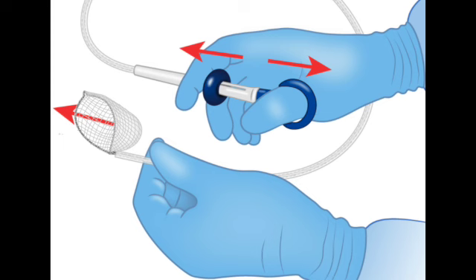Okay, so how do you maintain that orientation? This is another one of those clever, practical solutions. You take the large polyp, lay it out carefully, maybe spread it a bit flat, and then you pin it to a small piece of cardboard. Pin it, like with actual pins. Usually, yes, small pins, carefully placed. You're essentially stabilizing its shape, making this 3D sample behave more like a 2D one, preserving its layout.